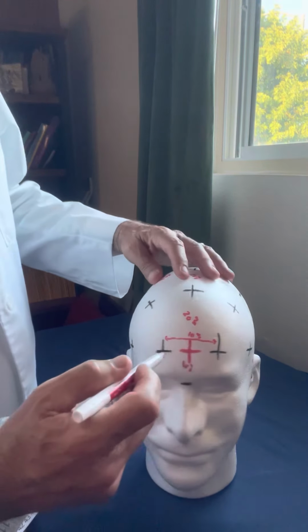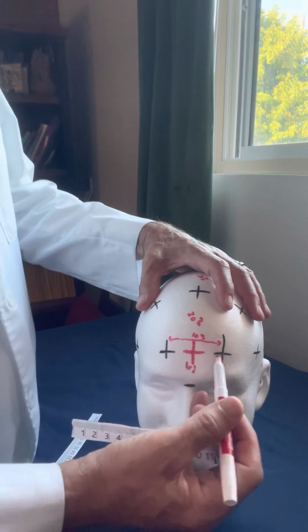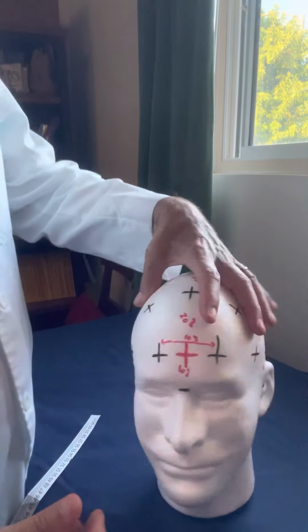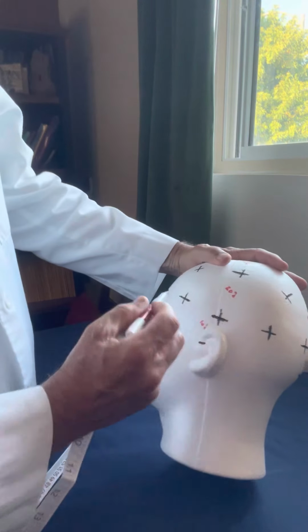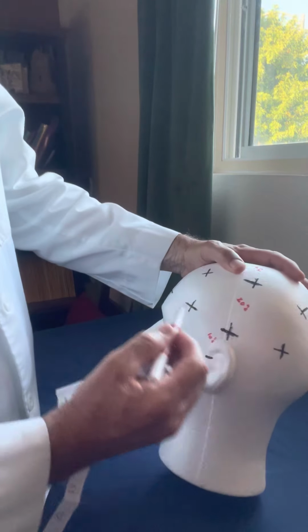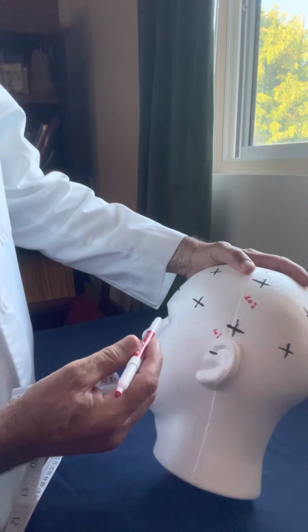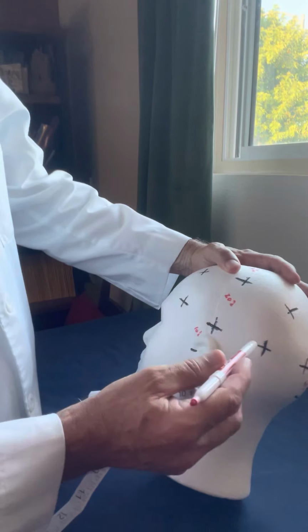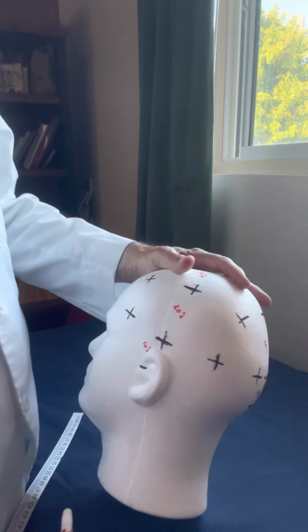So that's 10% here, 10% here. Let's remember that: that's 10% here and 10% here, that's 20%. Now let's go around the left temporal plane. Between each electrode in the left temporal plane should be 10% of the head circumference distance.